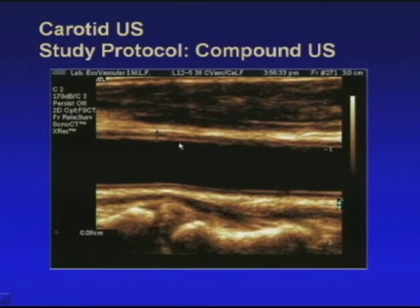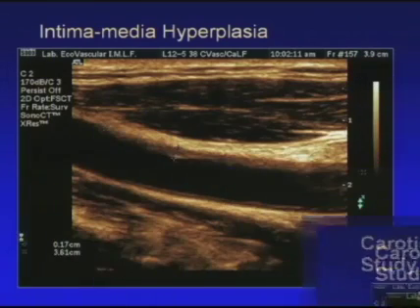By using different techniques, in this case some kind of color display in sepia, and using also extreme resolution and compound ultrasound, we can obtain a better definition, but always with the value under 0.9 millimeters to be considered normal.